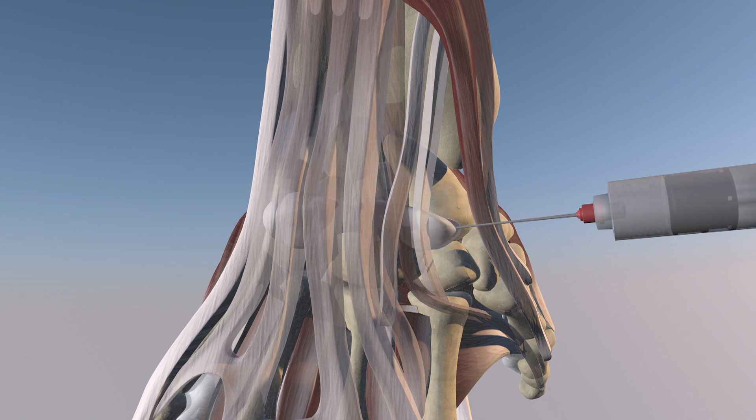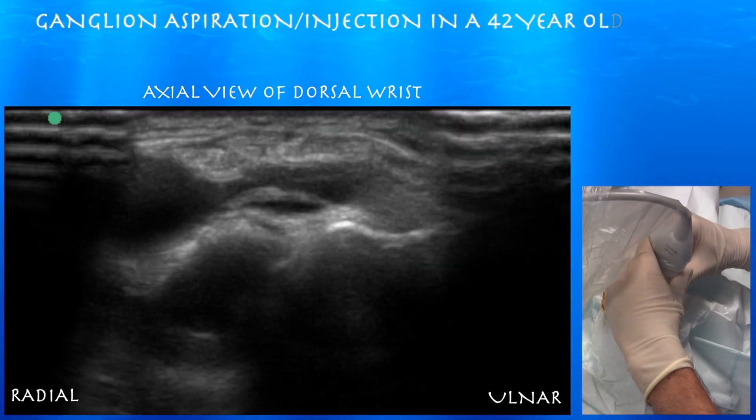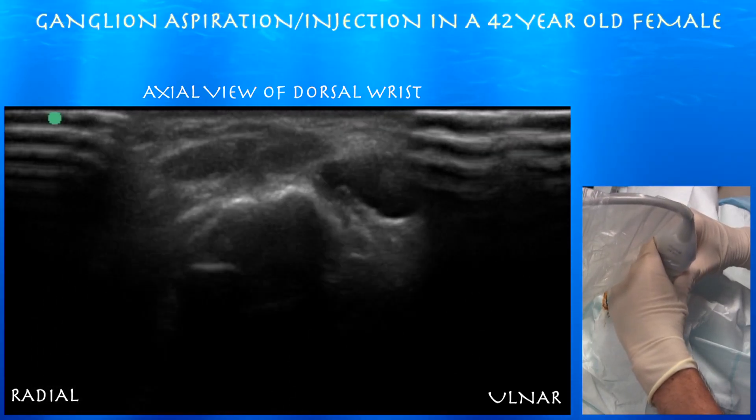Now we're aspirating. We got most of the fluid out of the cyst, but not all of it — the ulnar aspect of the cyst still remained. Here we are injecting cortisone at the end of the procedure. It looks like it's connected; it's bulging out on the side.